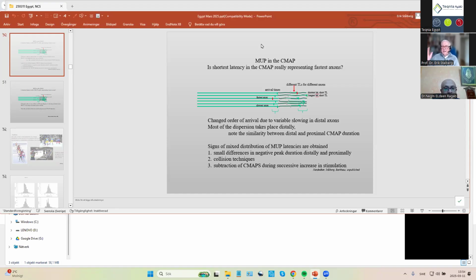But nowadays, we use antidromic recording from the finger, stimulating here, get the normal time, and stimulate here and record here. The difference between the long time minus this time will tell us this time, and that is prolonged in carpal tunnel. That is the current mode, and that is a very good thing. So we do not do the inching.